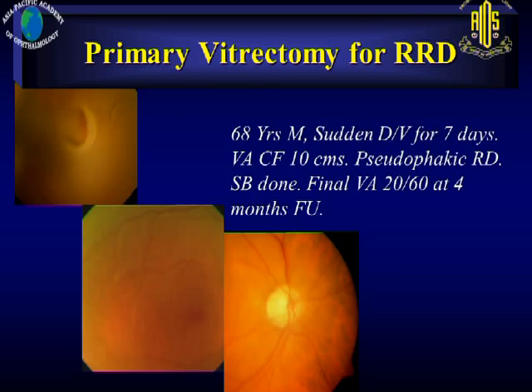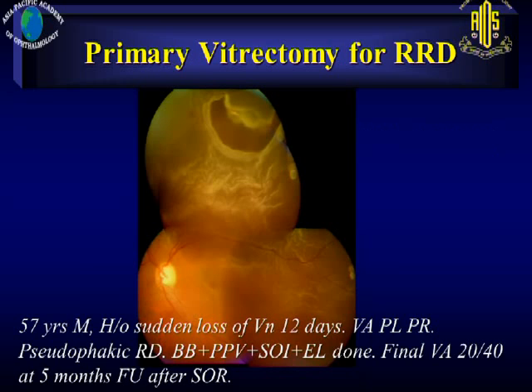However, as the retinal break increases in size, it becomes more difficult for us to handle with scleral buckle alone. So here the vitrectomy will be playing a major role. Inferior chronic break: my preferred modality is scleral buckle, though I am dealing with vitrectomy as a primary modality. This case exemplifies that vitrectomy is the only choice here, not scleral buckle. And if you see the posterior location, a large break and an active traction, all three will suggest that vitrectomy can be the primary modality.